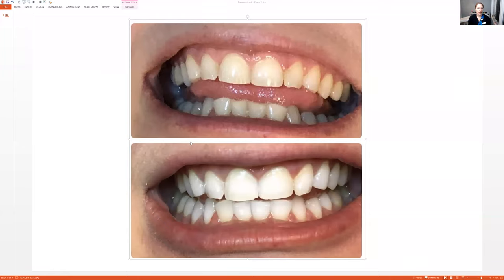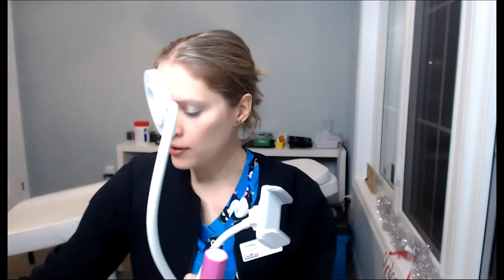Show patients their shade — that's the best thing to do. So when I do whitening, I do a before photo and an after photo. What I do is I clean the teeth first, and then I do my before photo where I have also purchased this light from Amazon — I want to show you guys this light. I had ordered this light on Amazon so that way I can use the same light for everybody. I just plug it into my power bar.